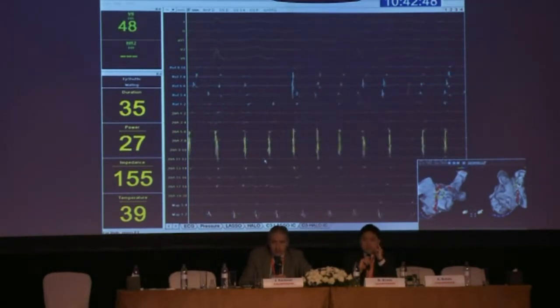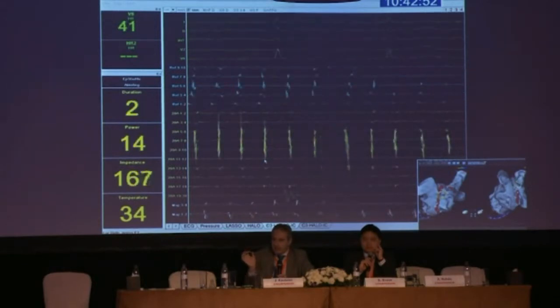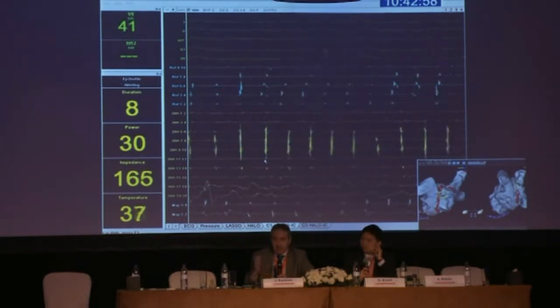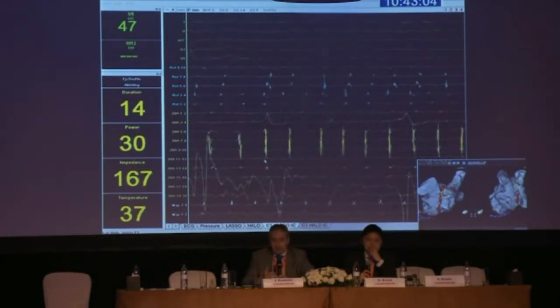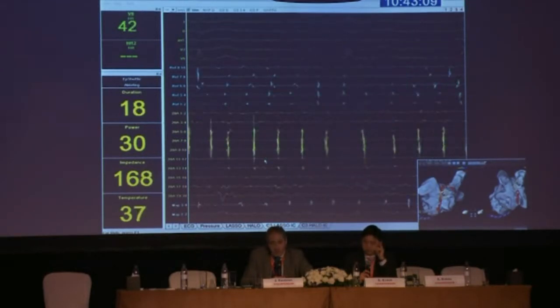That's also an advantage. Here you can hook the catheter in the ridge, like a few millimeters behind the ridge, and you can keep it there, which is very difficult sometimes with manual, or you slip out, so it takes some time to come back. Here you come back very easily without the need for using X-ray at all. So that's, in my opinion, one of the advantages.